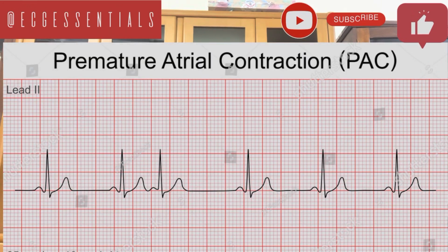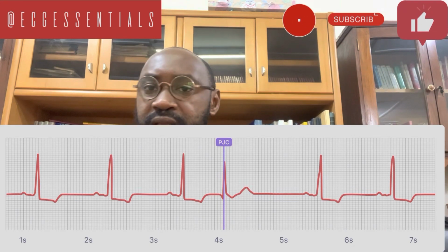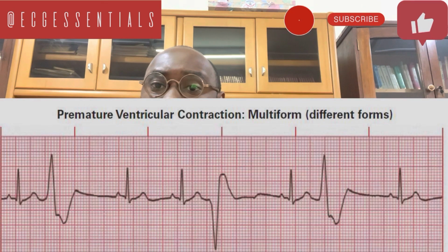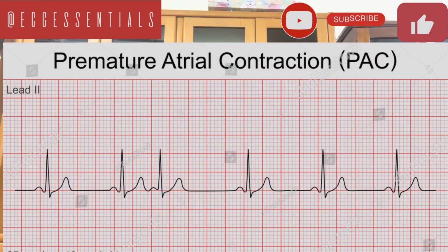And so we may have examples like premature atrial complexes, premature junctional complexes, premature ventricular complexes, and these are all arising from ectopic origins within the heart. Of course, because these are not coming from the sinoatrial node, we would expect that there will be some differences in terms of how the P waves will look, that is, if we are talking about premature atrial contractions.